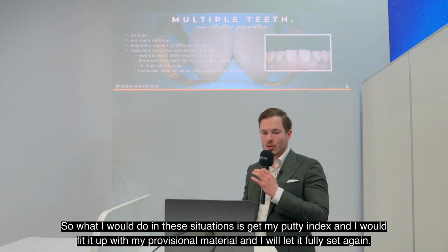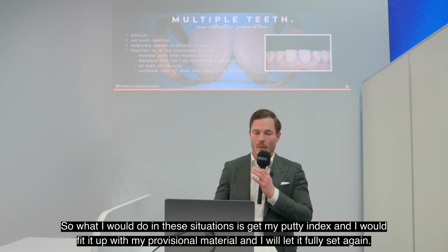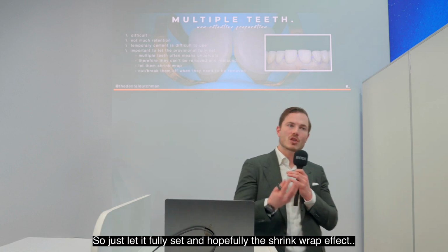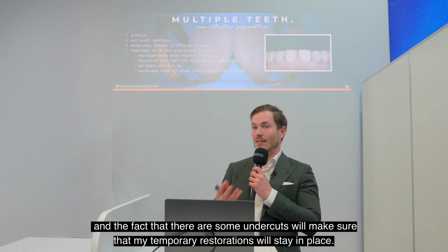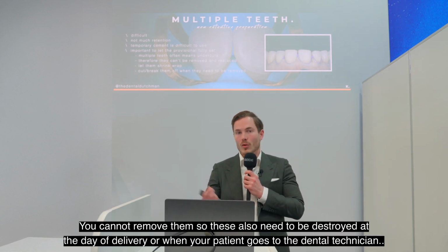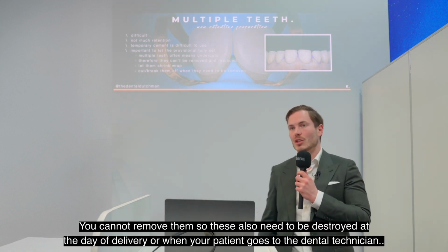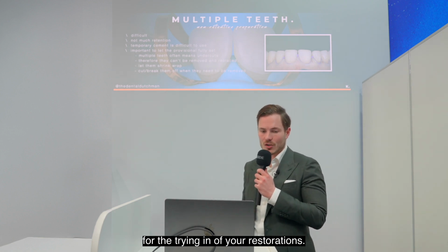So what I would do in these situations is get my putty index and fit it up with my provisional material and let it fully set again. So just let it fully set, and hopefully the shrink wrap effect and the fact that there are some undercuts will make sure that my temporary restorations will stay in place. You cannot remove them, so these also need to be destroyed at the day of delivery or when your patient goes to the dental technician for the trying in of your restorations.